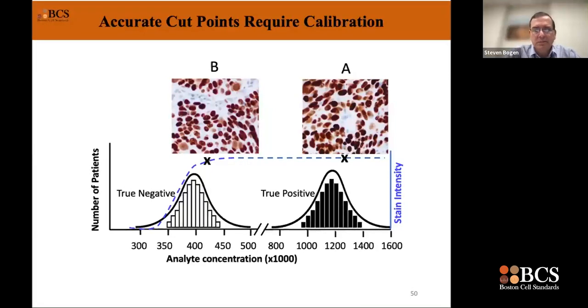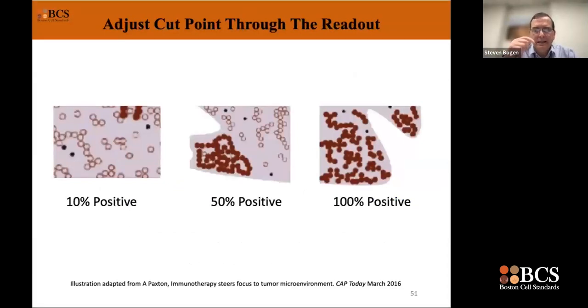If you're familiar with immunohistochemistry testing, you may be aware of a commonly used method to try to address this problem. Namely, in many instances, we'll increase the percentage of positive cells before calling the assay positive. So I suggest we explore that as kind of a second pitfall. The slide here illustrates the concept, showing different percentages of positive cells. For ER, estrogen receptor IHC testing, the cut point for treatment is usually in the 5 to 10% range. For Ki67, the recent FDA-cleared assay, it's 20%. And for PD-L1, depending on the assay, it's 50%.